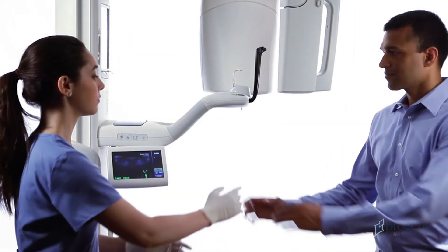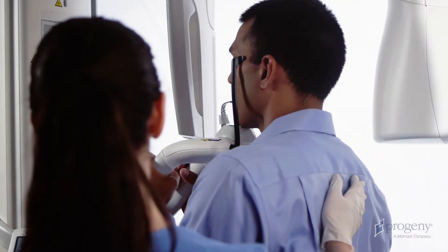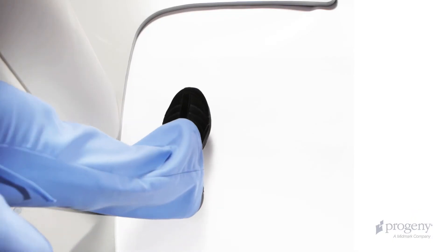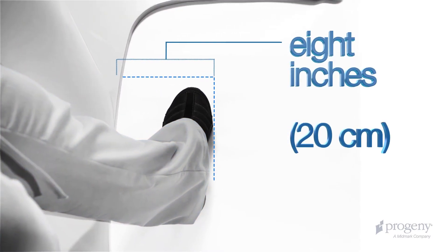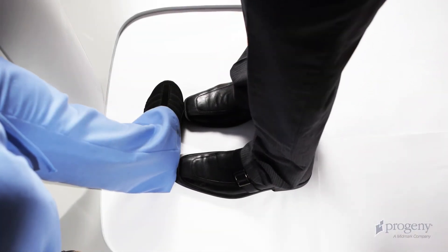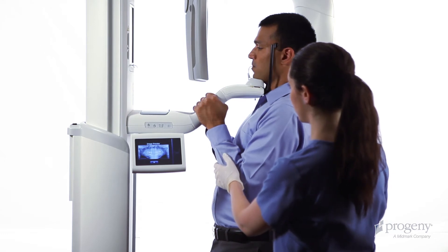Instruct the patient to place their hands on the stabilizing grips. Gently guide the patient towards the vertical column. Instruct the patient to bring the toes in contact with your instep, which will be placed approximately 8 inches in front of the vertical column. Ask the patient to now stand at full height and relax the shoulders.